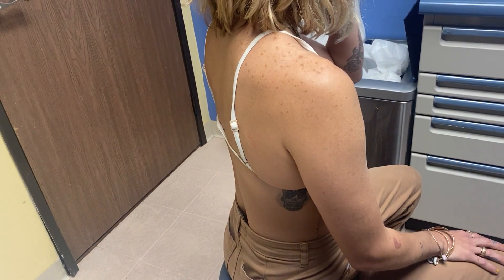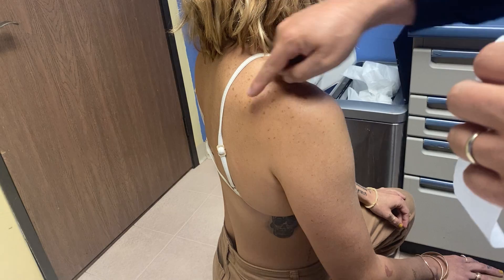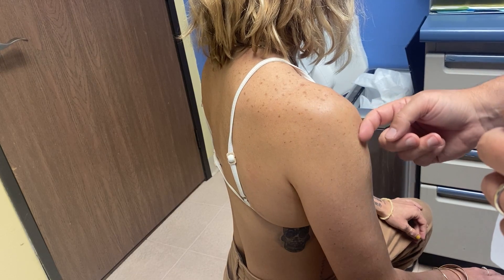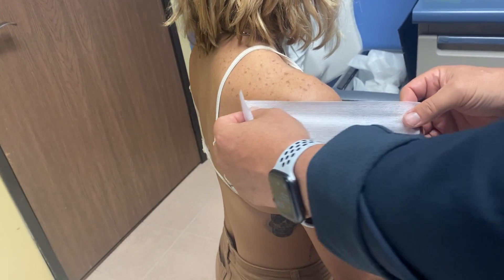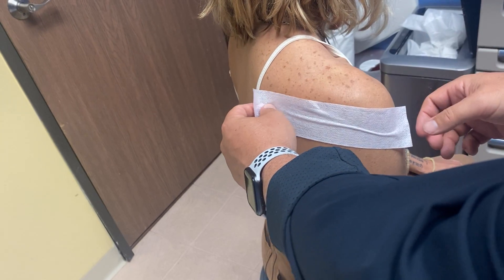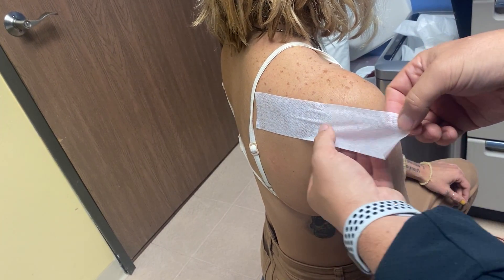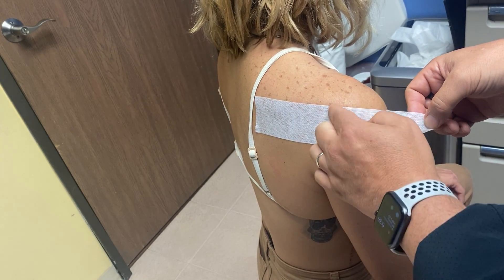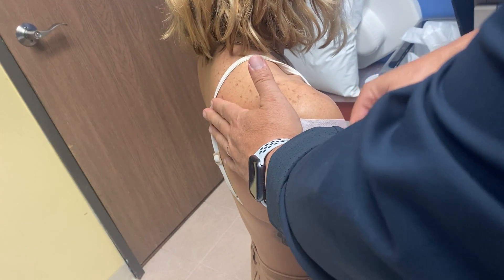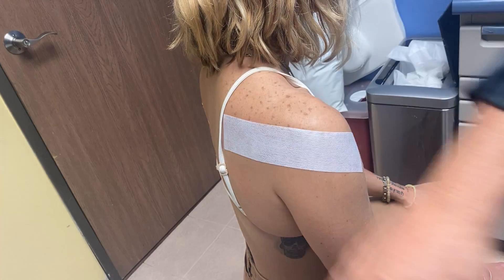This is four squares of BSN Medical Cover Roll Stretch. I'm going to place this underneath the spine of the scapula, maybe a little bit over the spine of the scapula, and wrap around. Here's the spine of the scapula — just right halfway on, wrapping far enough to the front of the shoulder. Then I do another one exactly the same, just one level down.